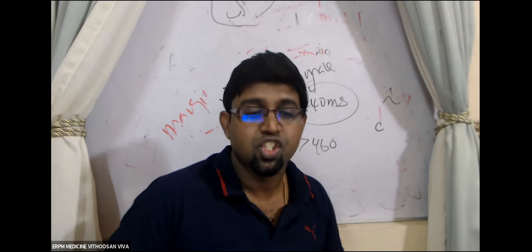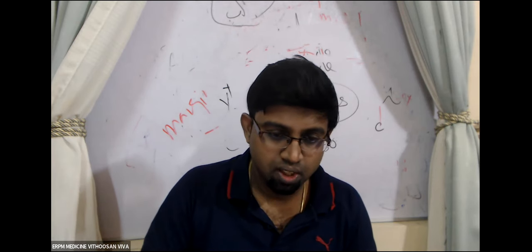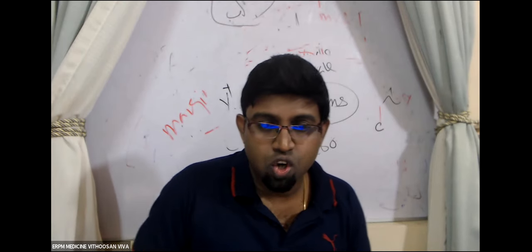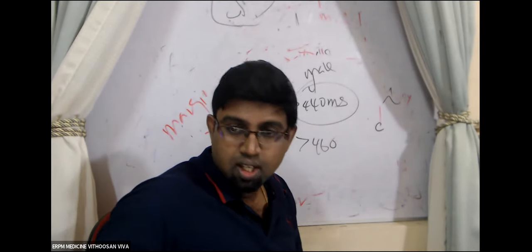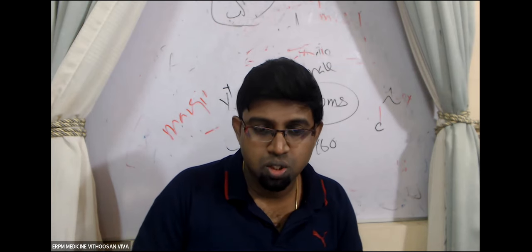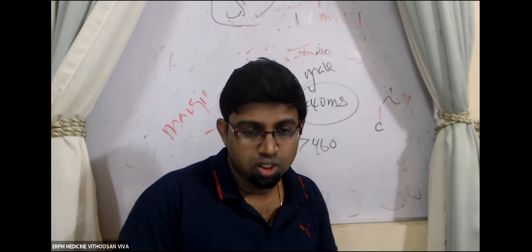QT interval changes with the heart rate. That is not the case with the PR interval. We don't talk about the PRc, but we talk about the QTc. Understood? Just know the QT interval changes with the heart rate.